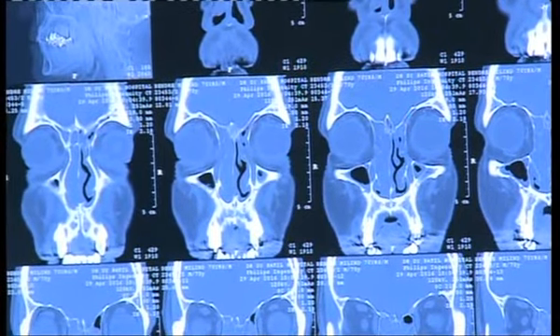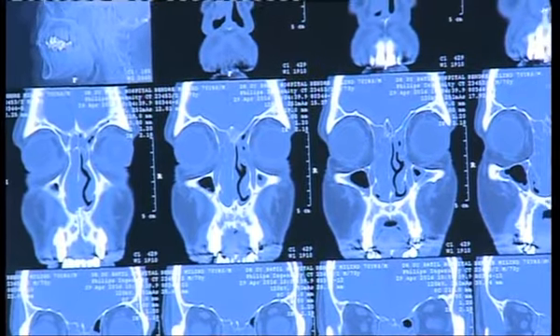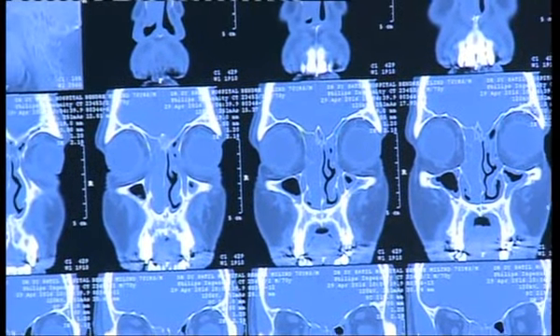So it helps you in locating the anteroethmoidal artery. There are two pneumatized cells. Okay, sorry, come back on track. Yeah, so that's a good question, I would say.